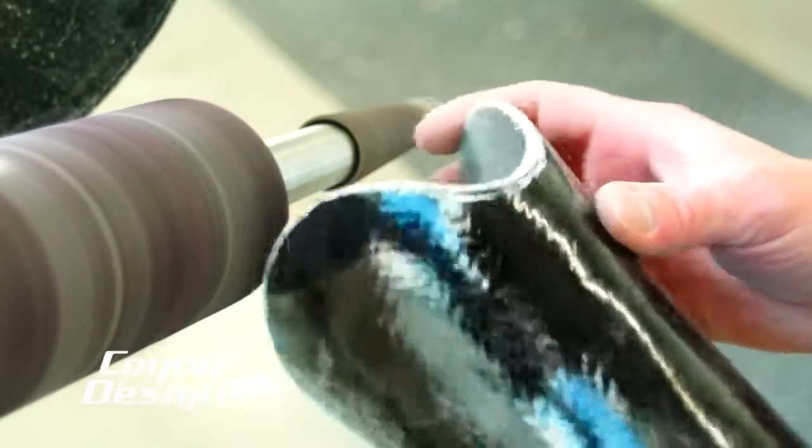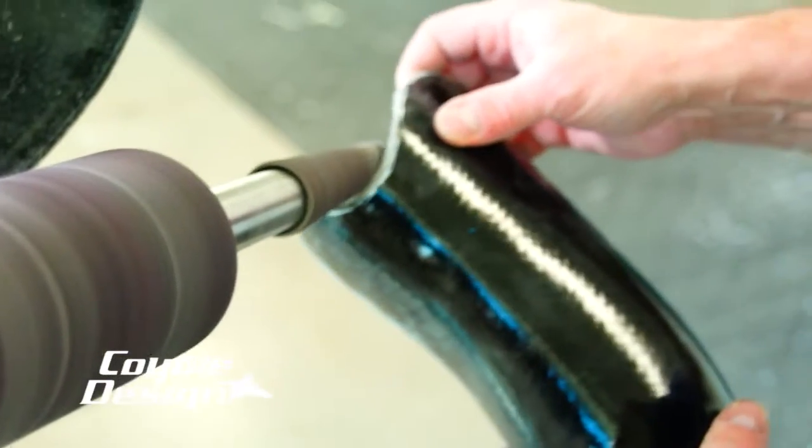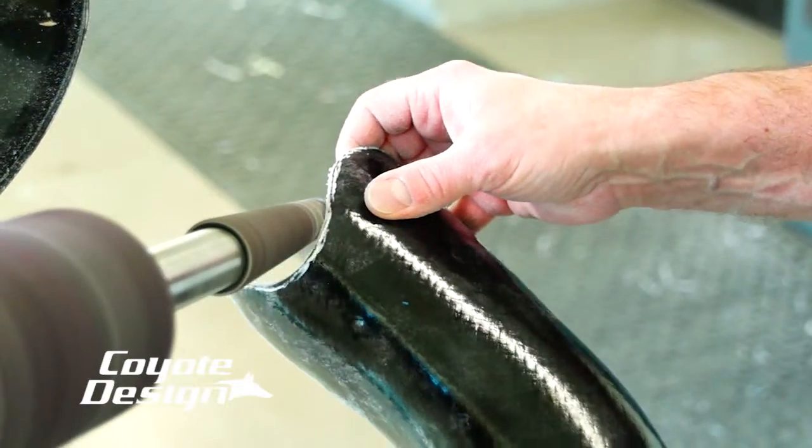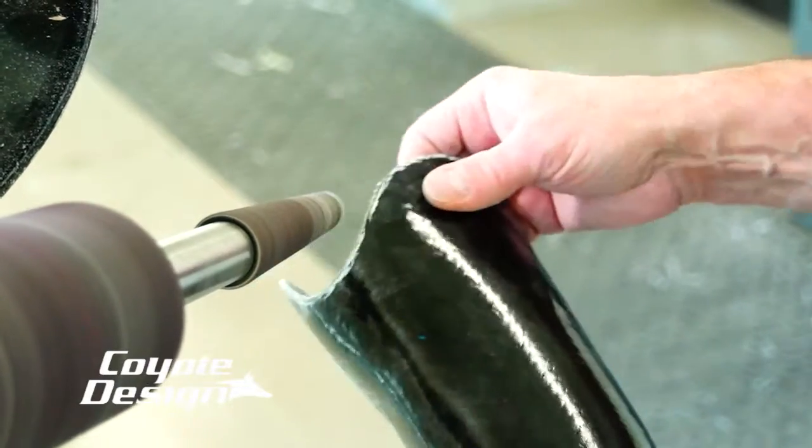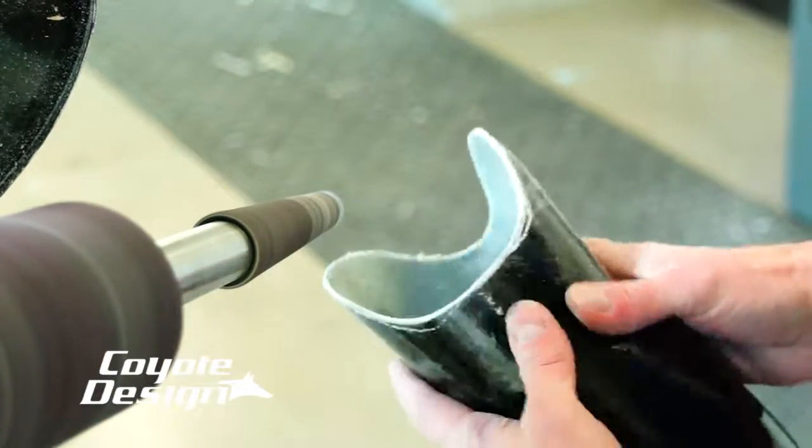If you're having trouble with it cutting and being too abrasive, go ahead and run your wheel on slow and try going with the wheel when you cut your Coyote composite. You'll find that it takes less off and it'll stop it from being weavy.